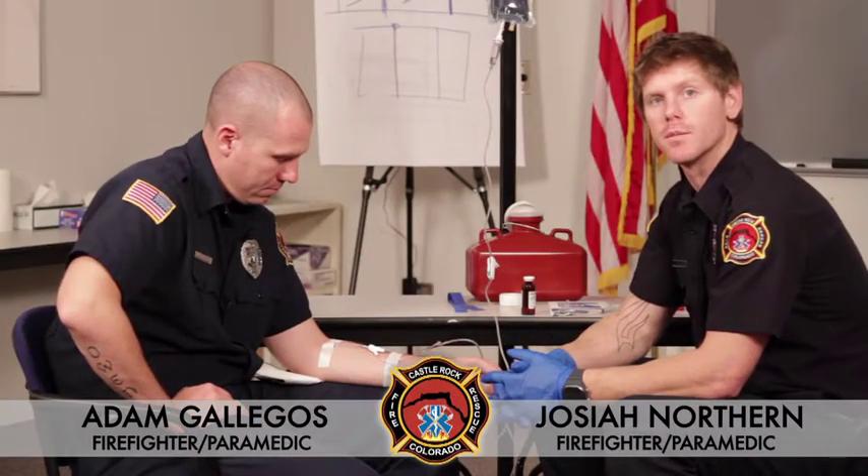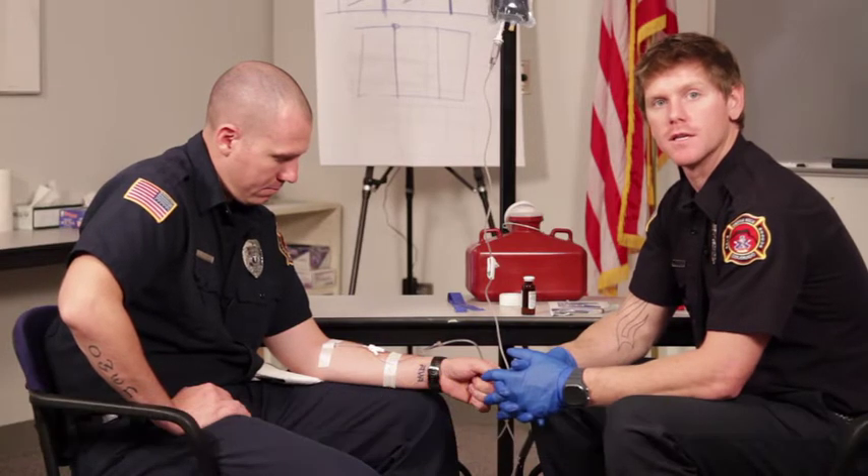My name is Josiah Northern. I'm a firefighter paramedic with the Castle Rock Fire and Rescue Department. Today we're going to be going over IV bolus medication administration.